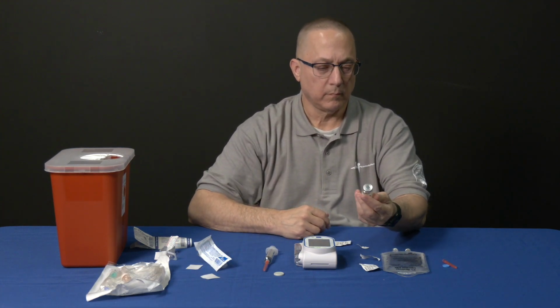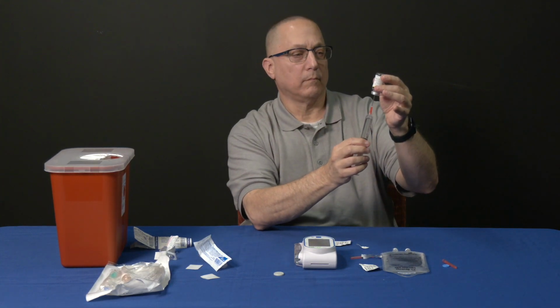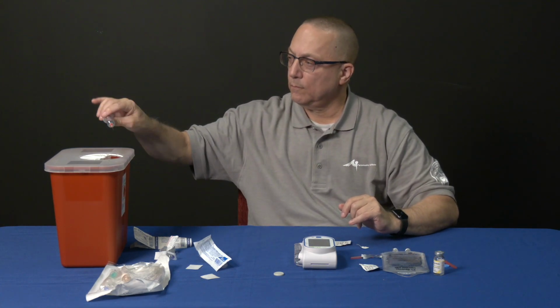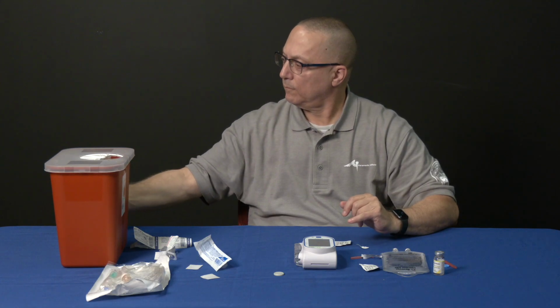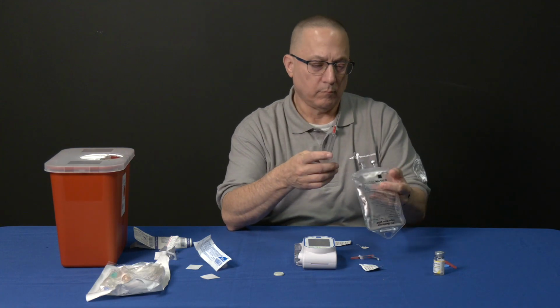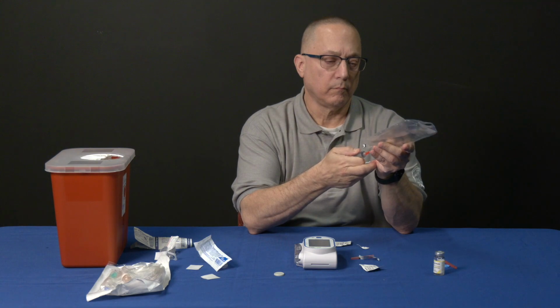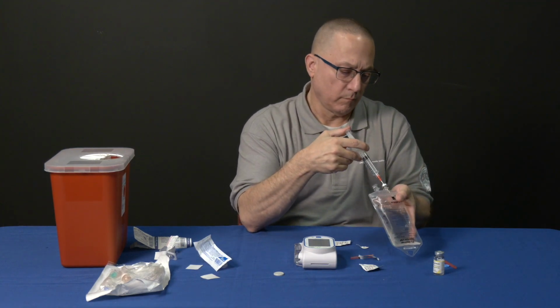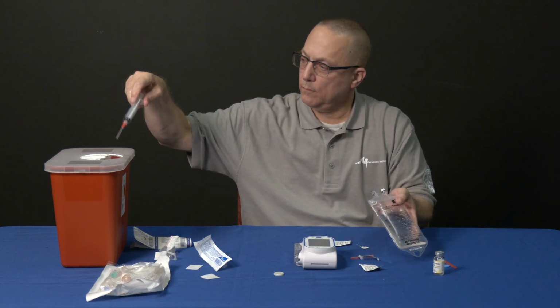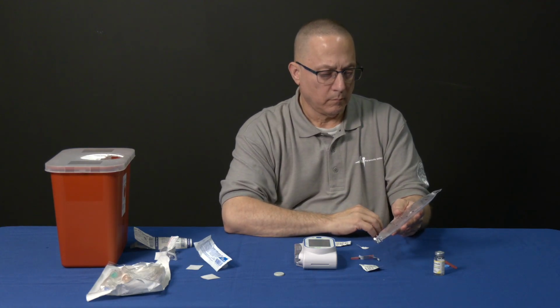Next, draw up the 10 milliliters of calcium chloride into the syringe. Inject the 10 milliliters of calcium chloride into the medication port of the bag of D5W. Safely dispose of the needle and syringe in a sharps container. Gently mix the medication and its diluent by tipping the bag back and forth.